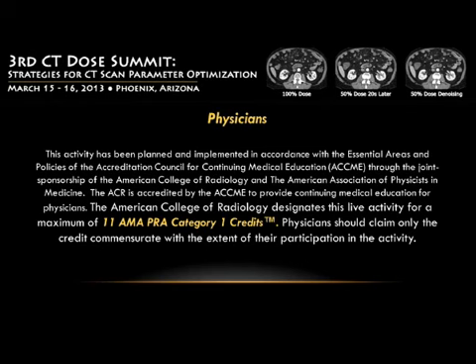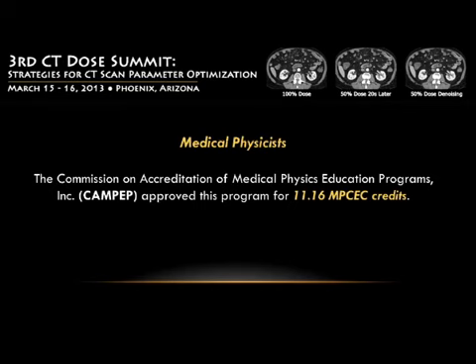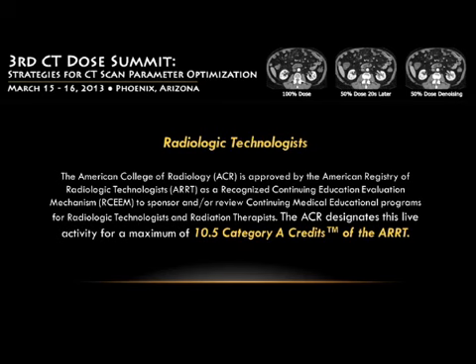I have a question about the GE. So when the radiologist sets the noise index, who sets the maximum MA? Is it the scanner that automatically does it, or do we randomly select a maximum MA? Well, there are default protocols that come with the systems, and a maximum MA will be set with that.